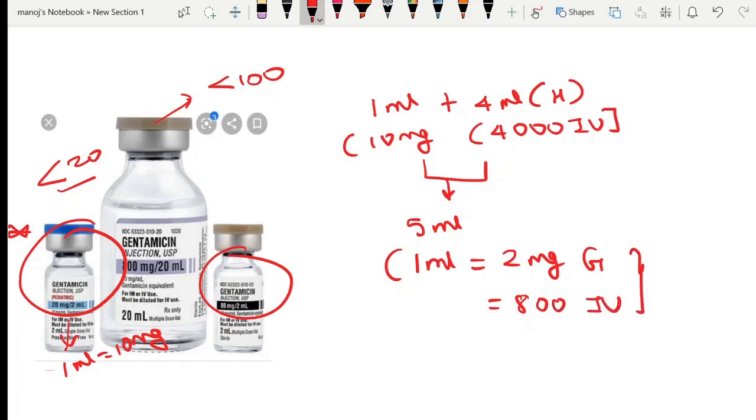This is the gentamicin plus heparin locking solution which is required for permacath locking.